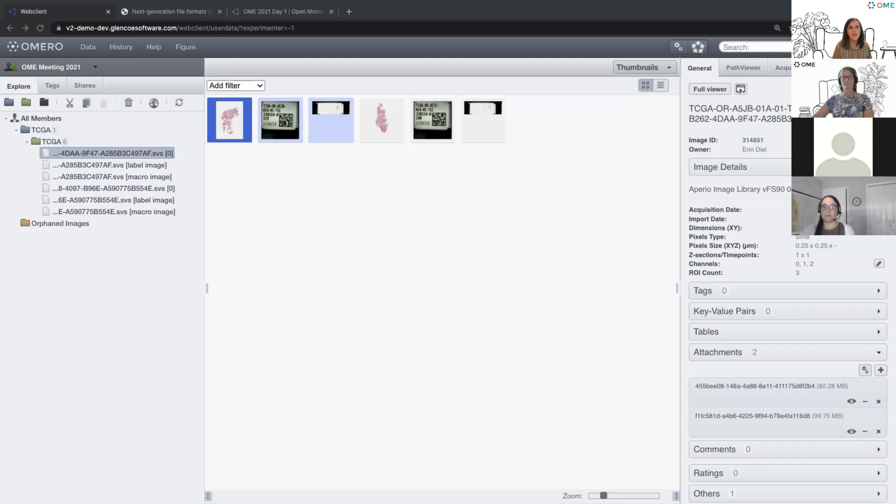And the second is that the data structures that I'll talk about today for this derived data, like OMERO tables and OME-ZARR, are also very compatible with open source viewers. And one example of this is napari. The OME team has done a lot of work to provide a plugin, napari-ome-zarr, to be able to open OME-ZARR data in napari as an example. And that's compatible with both images and the segmentation data that I'll show today.